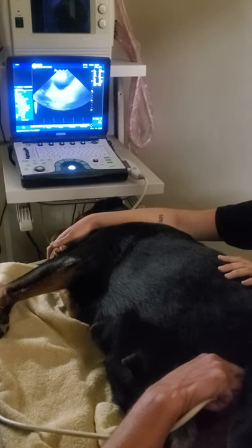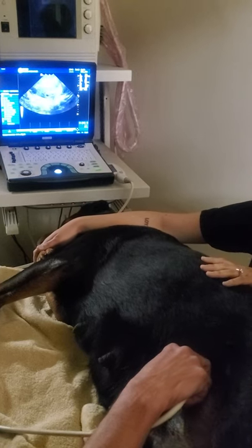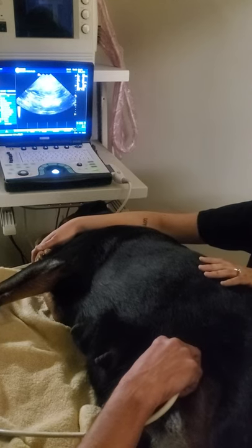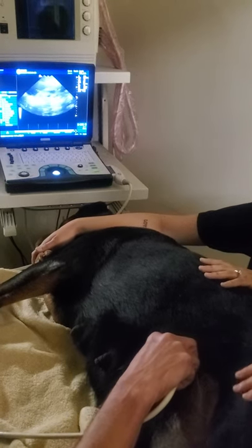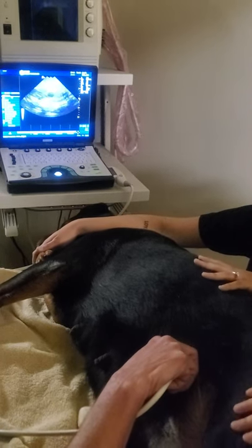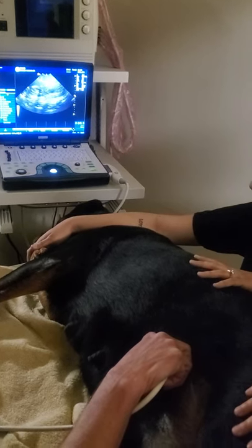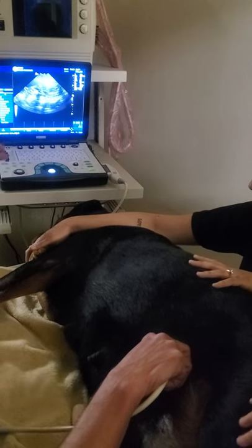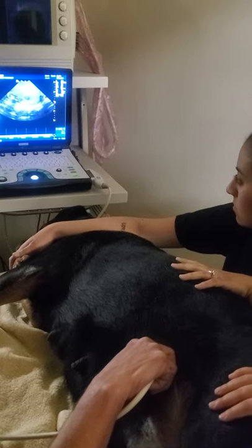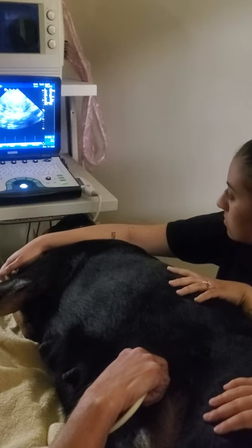Looks like I'm seeing four on this side. Looks real close, right here — little black spot. You can see little white spots flicking on the inside. That's the puppy's heartbeat. Little heartbeats.